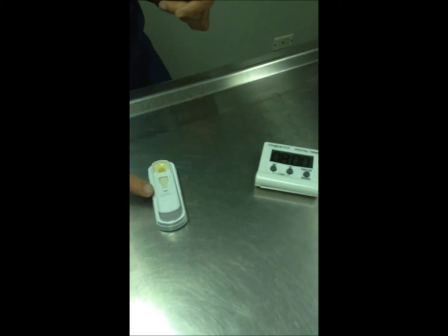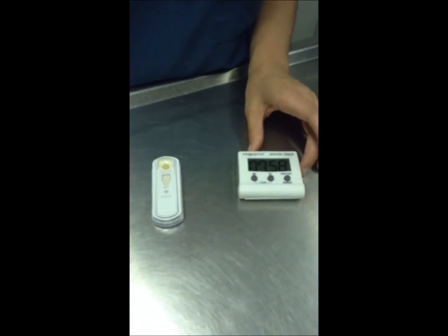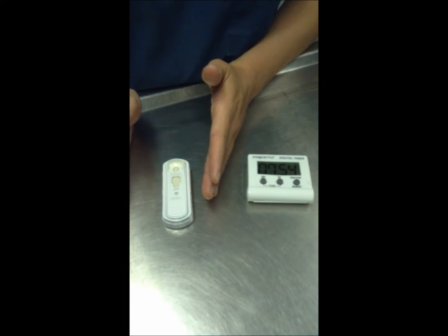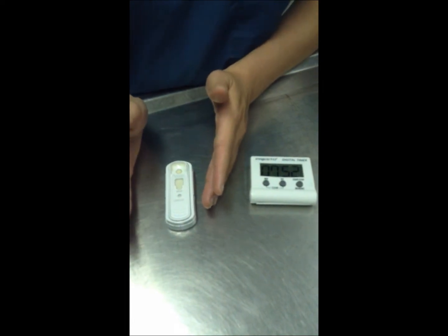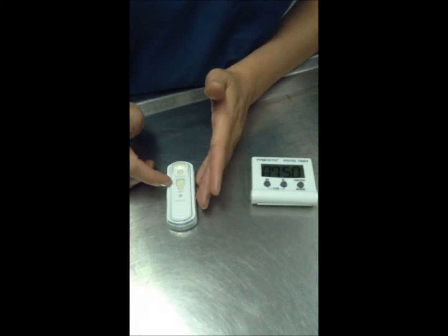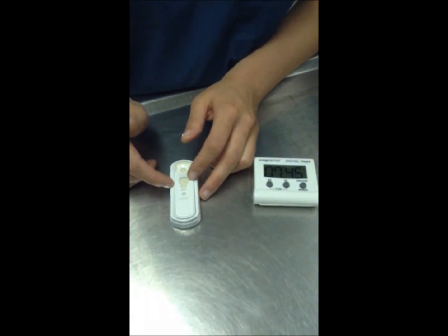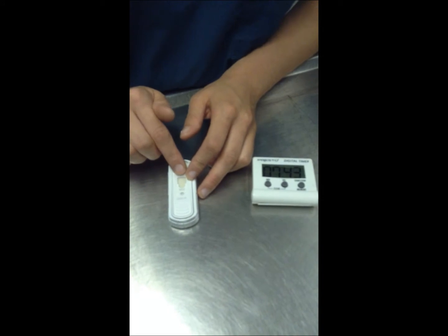Okay, so the circle's completely filled. So you snap it down, you start the test, it runs for 8 minutes. There's a control dot. If it's negative, it will have an additional dot over here. If it's positive, there will be a dot over here. The control dot will show up over here.